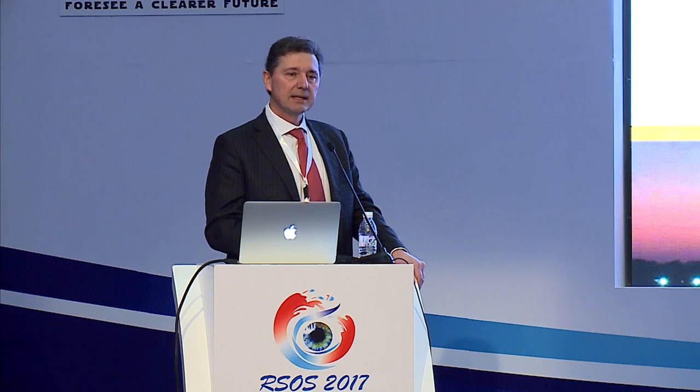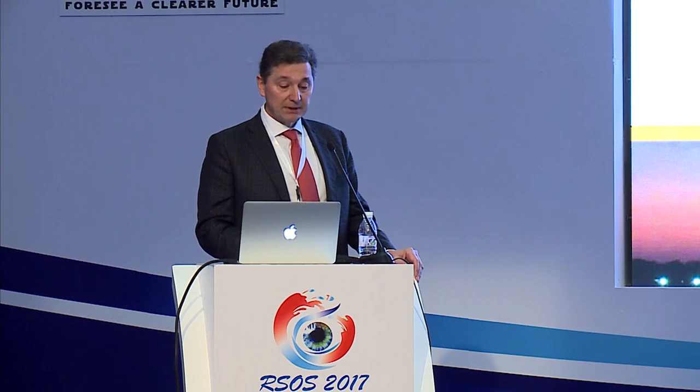Pupil size and multifocals. I've been victim to this myself, sometimes putting a multifocal in for a patient where the pupil just isn't mobile enough, and the lens then behaves a lot more like a monofocal, and they don't get the effect of the other rings. So the pupil needs to be mobile, it needs to be able to dilate.